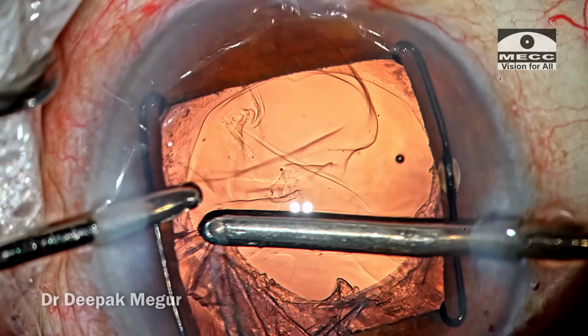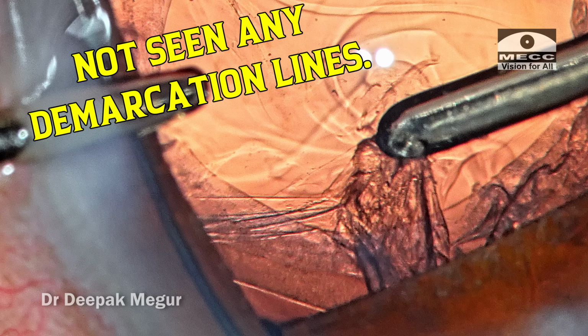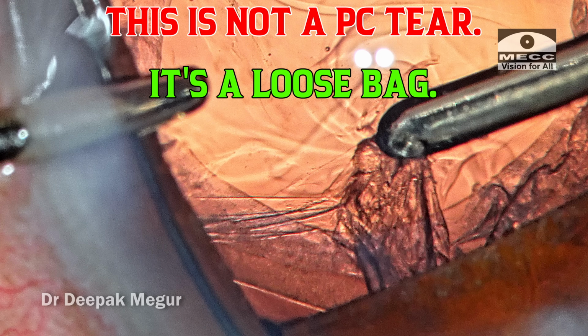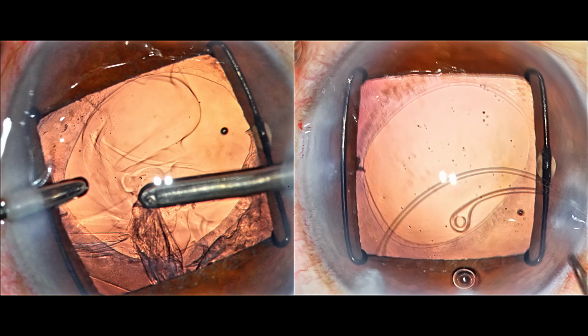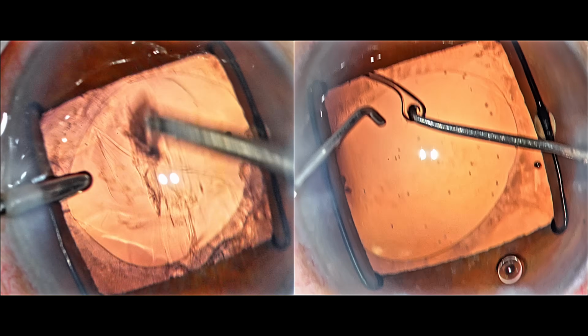If you're suspecting a posterior capsule tear, then a CTR is contraindicated, and on the contrary, if the diagnosis is zonular dehiscence, then CTR is the one which is going to be used. So there's a reason why getting to know these subtle signs is important for us to address this situation if it arises in the future.